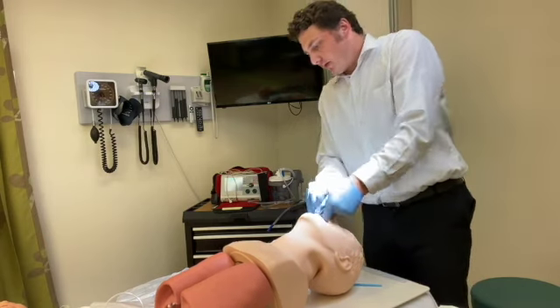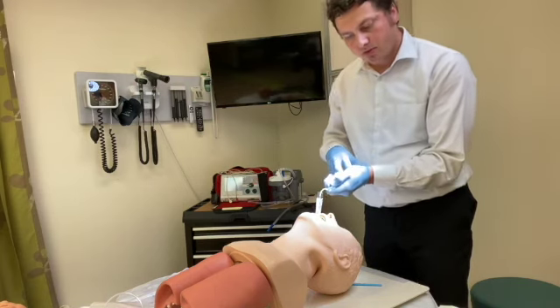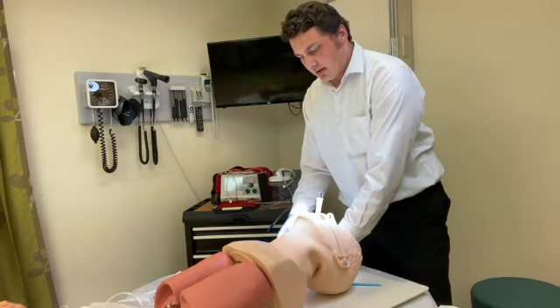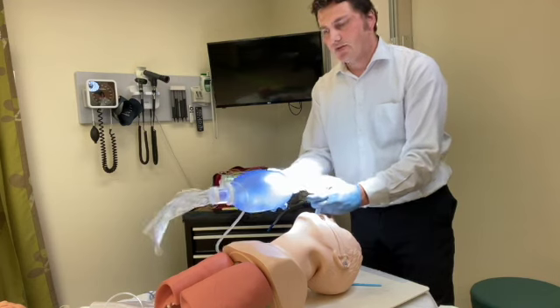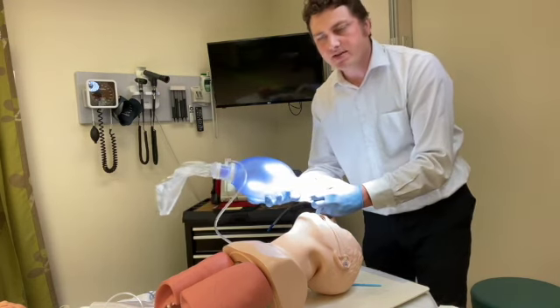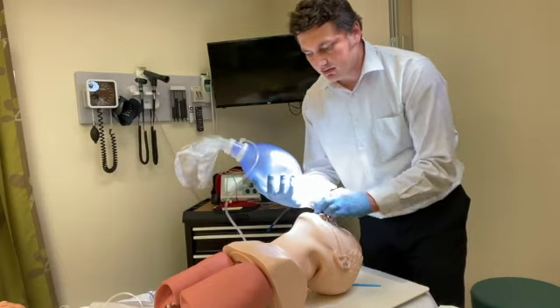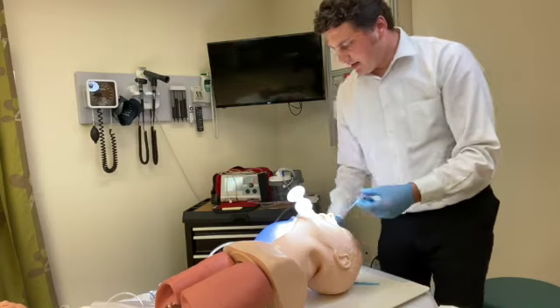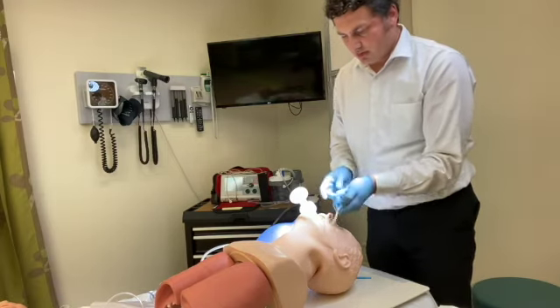Once it has been properly placed, now you're going to inflate the LMA, and then you can attach the bag valve mask. And this will establish somewhat of an airway, but it's not as effective. You can see some of the lung moving in this case. So take it out, use the syringe, open that up.